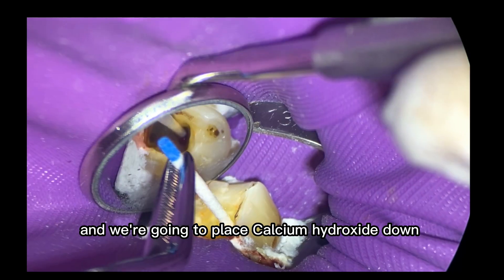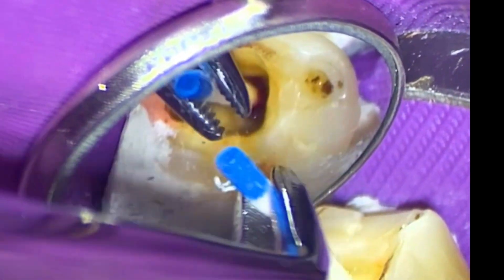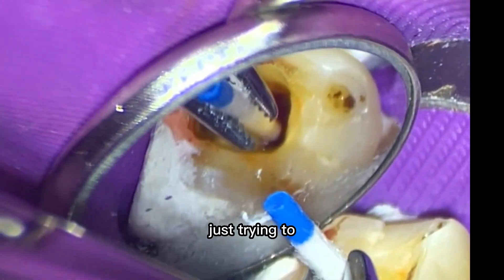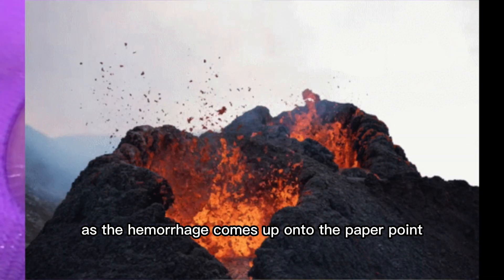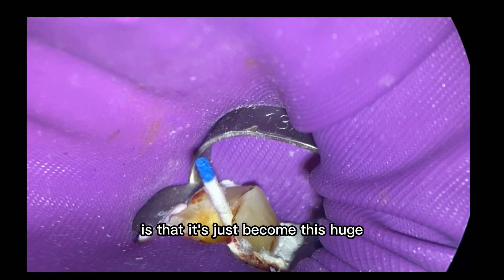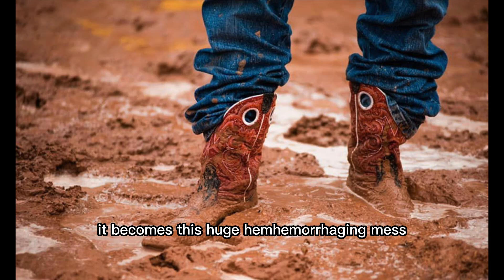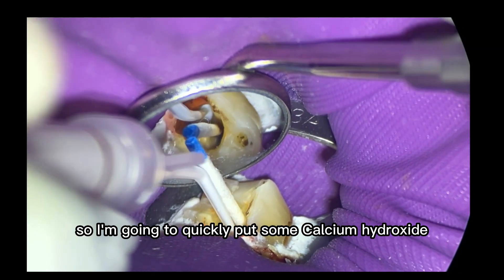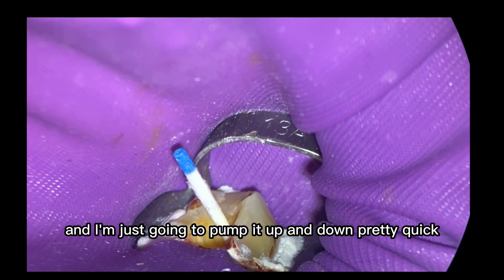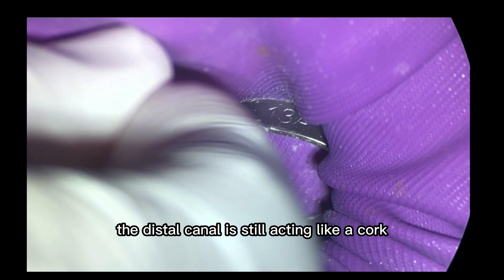We're going to place calcium hydroxide down the mesial canals. What I did was use it like a cork just to keep the hemorrhage from going into the mesial canals. I'm putting a little bit of apical pressure there — as the hemorrhage comes up onto the paper point, I'm just putting more apical pressure. Because what I've done before is it just becomes this huge hemorrhaging mess and it's really tough to see what's going on.